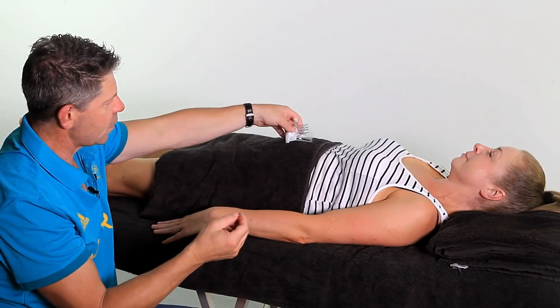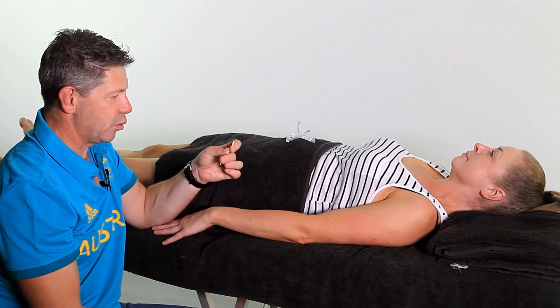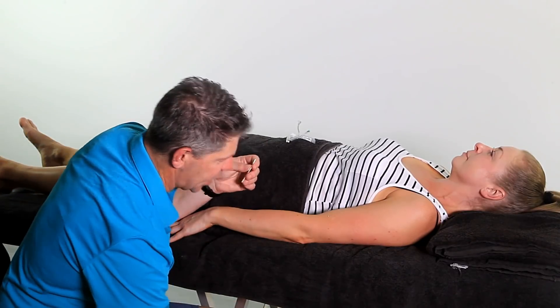The needles we're using are tubed — you've got a guide. I always tend to use these, and they're obviously not reusable; they are disposable. They come with a little tab — put that in the sharps container.